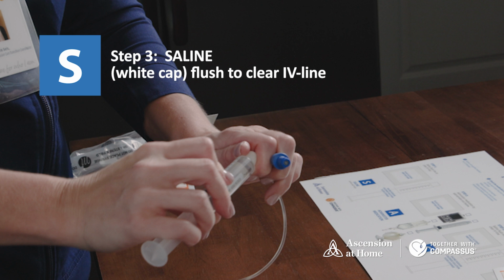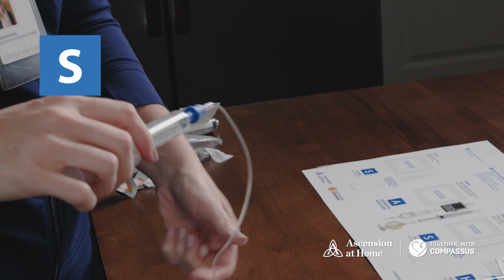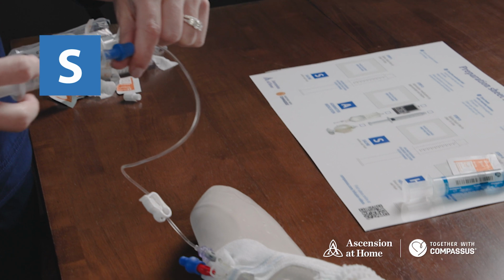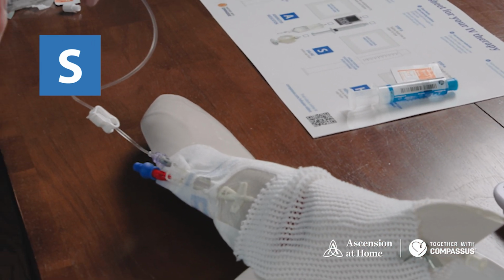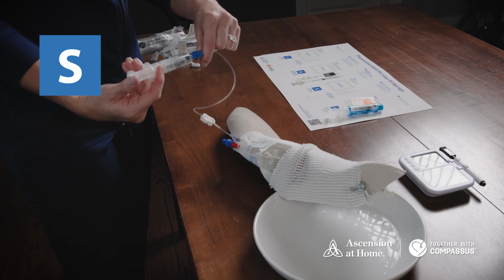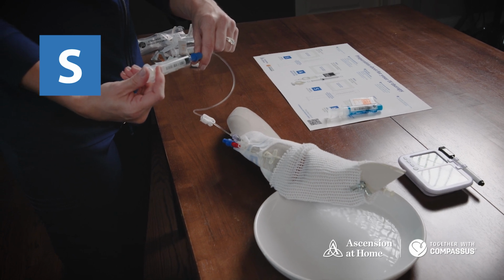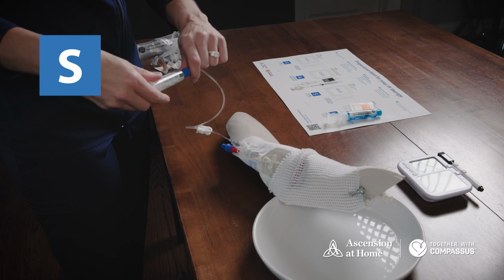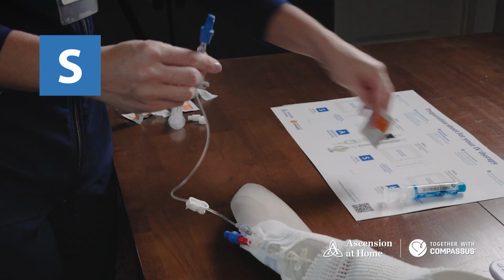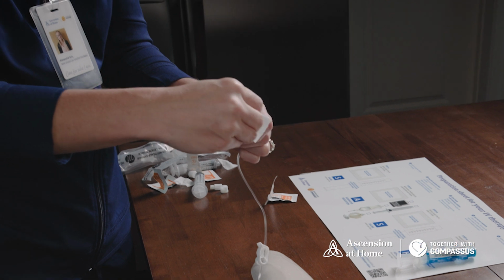Remove the cap from the saline syringe. Attach the saline syringe to the clave by using a push and clockwise twisting motion. Unclamp the tubing and flush the line with saline using a pulse or a push-pause method. When the entire syringe has been administered, clamp the tubing and remove the syringe and discard into the trash. Be mindful not to touch the clave. Pick up the next alcohol wipe and scrub the clave for 15 to 30 seconds and allow to air dry.